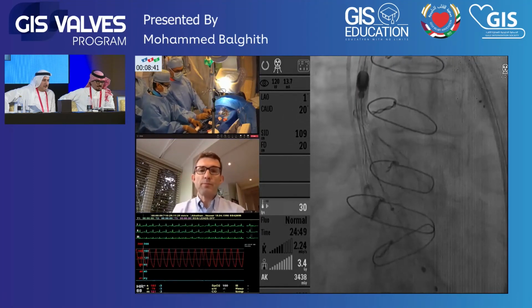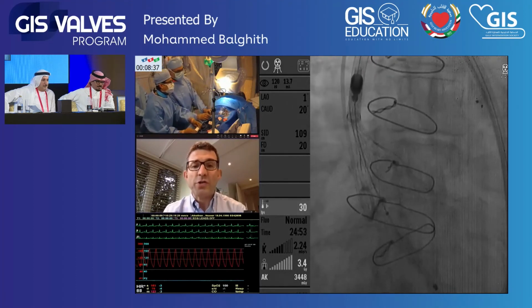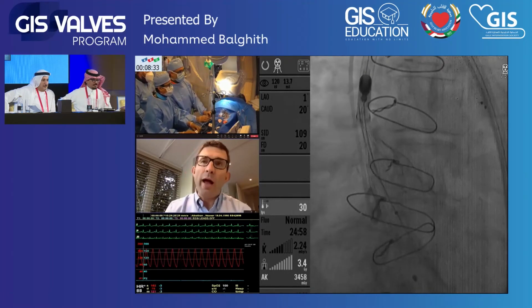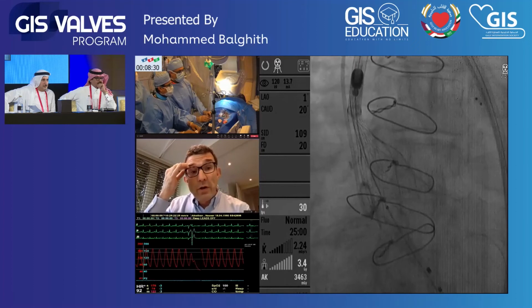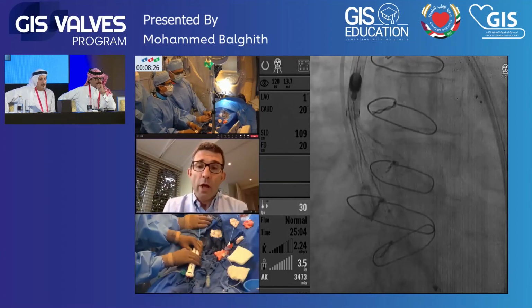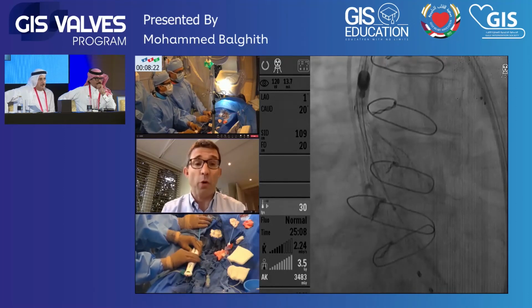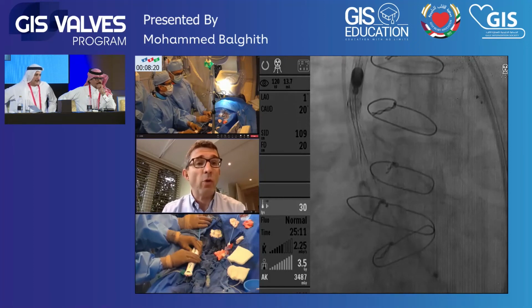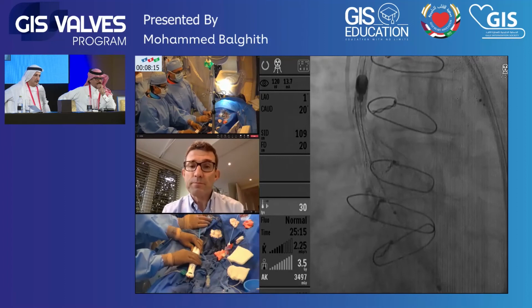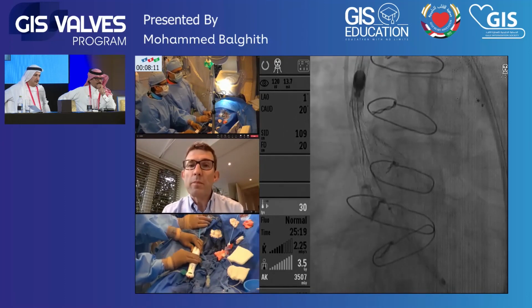Okay, we can go, right? So I think now at this point, what I tend to do is release the valve quite slowly. Yeah, we push the button already, and I will go slowly to release the valve in the same view. Full turns of the wheel until the valve is not capturable. So even at this point, the valve is recapturable and repositionable. Keep in this line, we can also recapture. Yeah, it's okay.